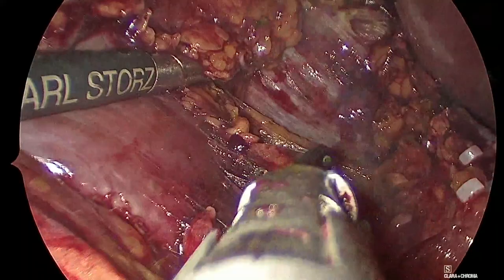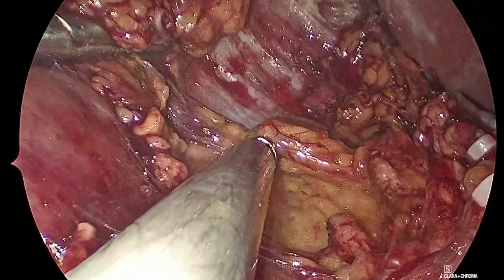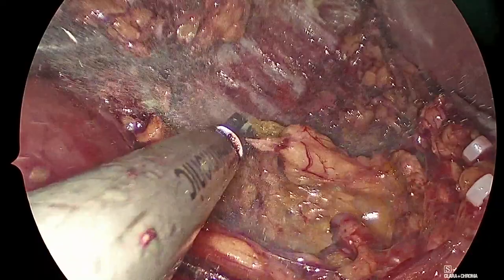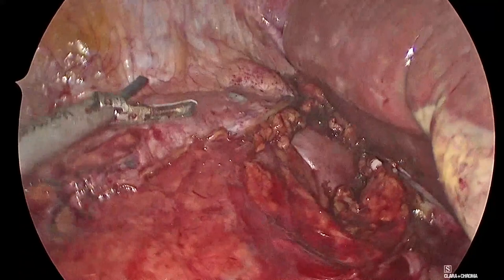So we can use these instruments as dissectors. Yeah, so now we see the suprarenal gland over here, okay, the adrenal gland. So we just take a couple more bites, and then we will go at the level of the lower pole, just to lift everything up and expose the hilum, okay? So let's go back. Okay, so now the upper pole is free.